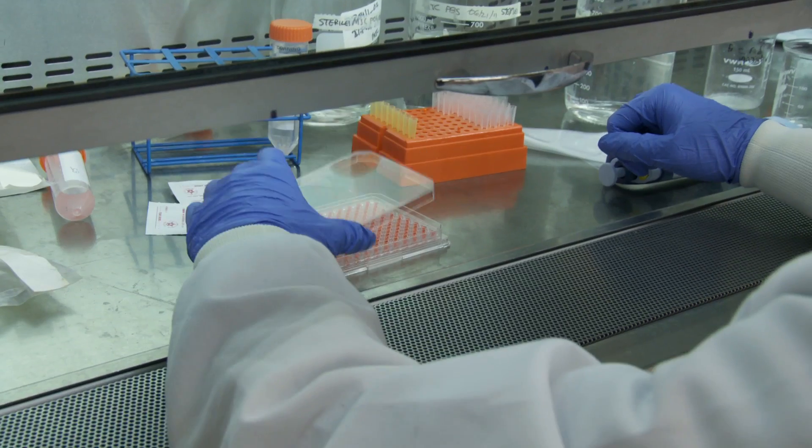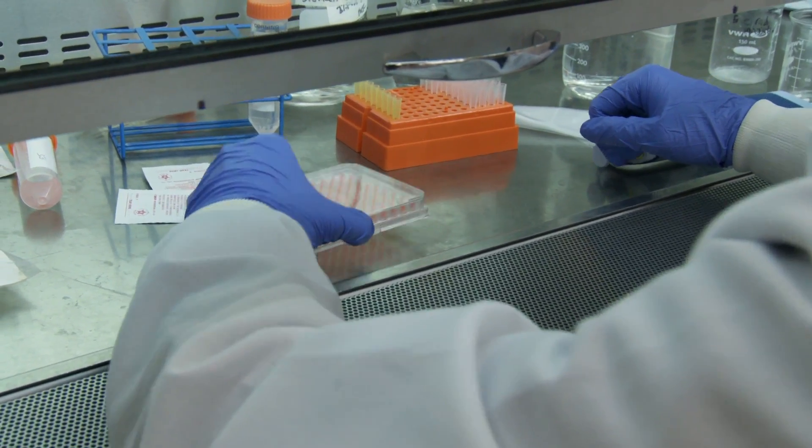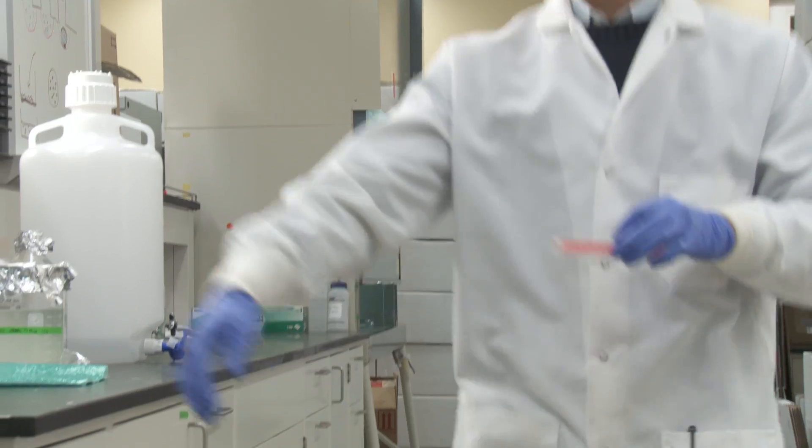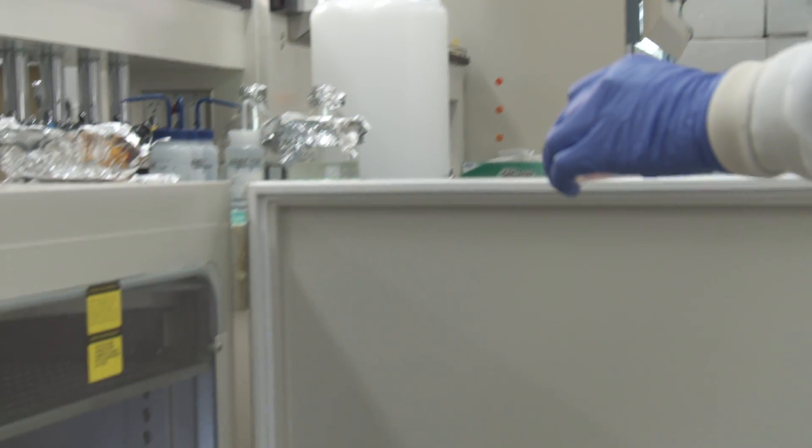Spheroids develop between one to five days depending on the cell line. Over 25 different cell lines have been used with our hanging drop plates, and that list is growing. It's a stable three-dimensional environment, and cell cultures are simple to grow within our plates, working with existing equipment.